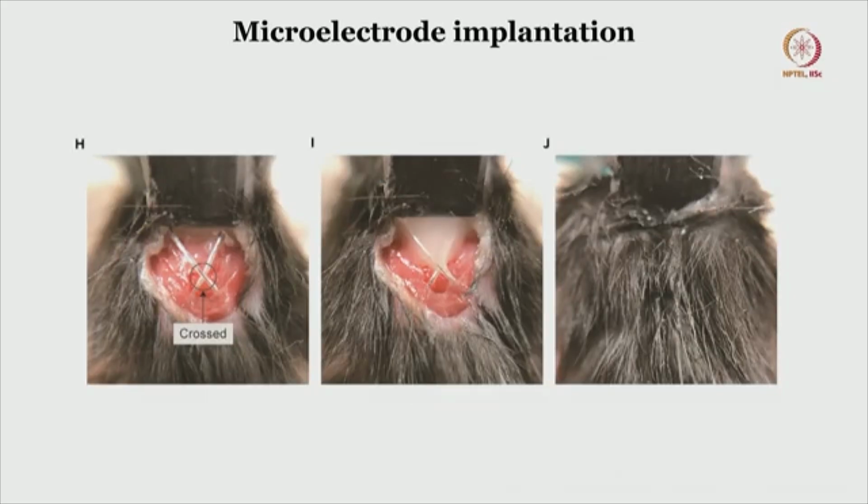So once that is done, then comes the anchoring part, that you need to hold the implant in place and cover the area with the skin, alright. So what you are seeing here is basically the bottom of the implant, and these are the skin edges that are brought close to the midline. The EMG wires are crossed to account for the stress and strain that can happen with neck movements, and also to give a good rigid fixation that the entire setup is going to be within the acrylic, which is shown here. So once the acrylic is placed into the defect, the skin edges are brought together and closed either with suture materials or with staples.